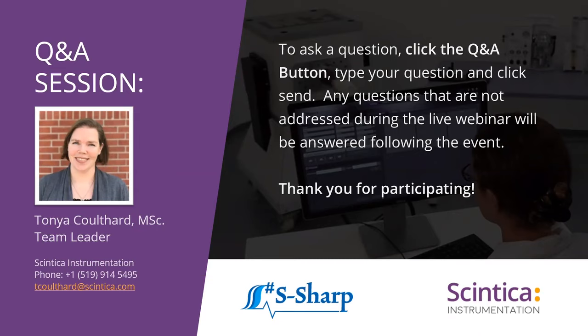The minimum step size is 0.05 millimeters, so quite small. And again, you can increase that if you want the acquisition to be faster and you're not as concerned about the out-of-plane resolution. But again, that's going to take multiple B-mode images in 2 dimensions and stack them back together. I like to think of it as like my loaf of bread. I've got my different slices, and when I stack them all back together, it looks like the entire loaf, which I can then reslice in any orientation that I want as I view that image within the visualization software.